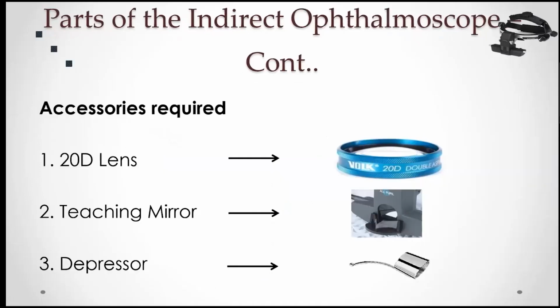And for using this indirect ophthalmoscope, you need some accessories. So the 20 diopter lens. Without this 20 diopter lens, you may not use that equipment. So you need the 20 diopter lens. And the teaching mirror helps the assisting doctor look at the same image that could be seen by the examiner. And this is the depressor to indent the eye, to have the peripheral look of the patient's eye.